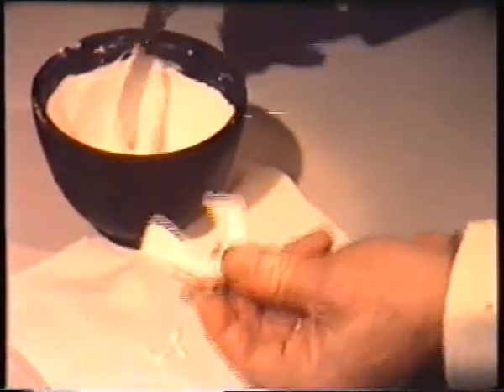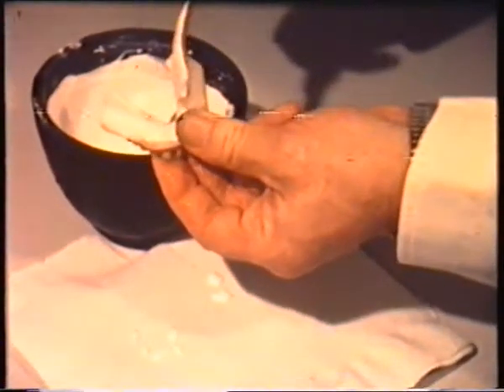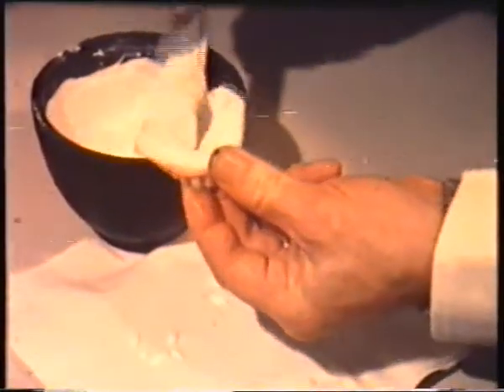Should the impression surface be satisfactory, then a model should be cast into the denture immediately to minimize the possibility of distortion of the impression material. Rebasing of the denture is done as quickly as possible, and the patient should now be able to continue for several more months before rebasing, duplication, or new dentures will be required.